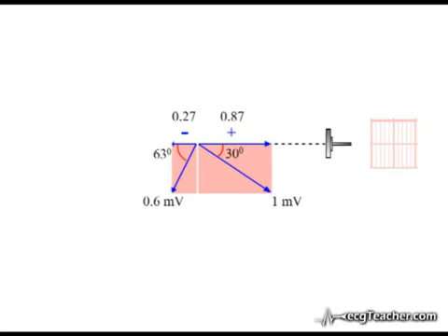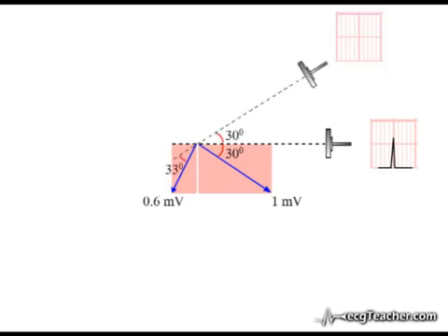The total depolarizing signal recorded by the lead is therefore 0.6 millivolts, a positive overall signal producing a strong R wave of 6 small squares in our model readout. Now consider a second lead sensing these events 30 degrees anti-clockwise from lead A.